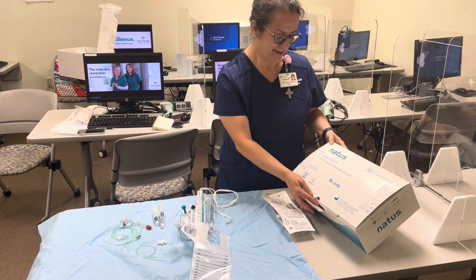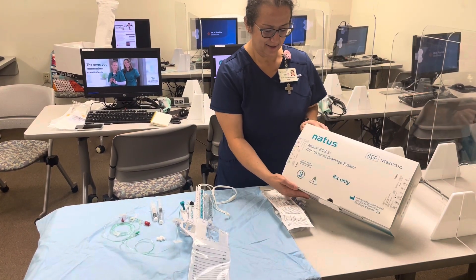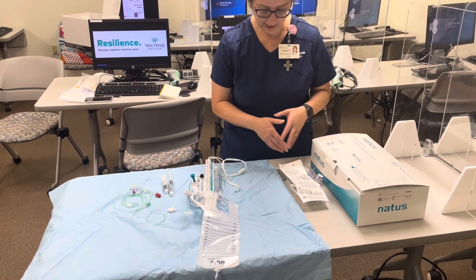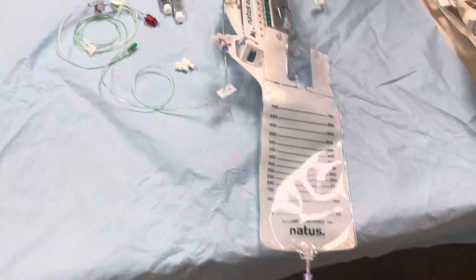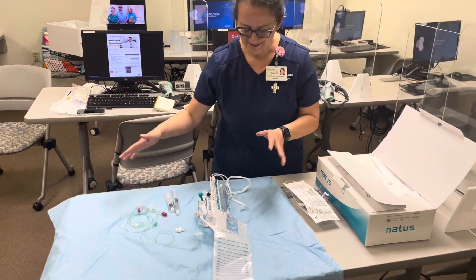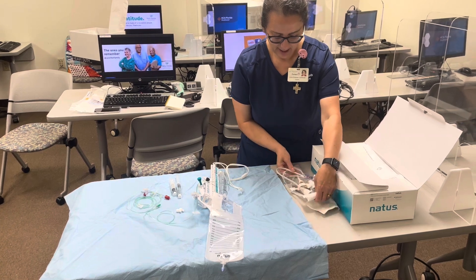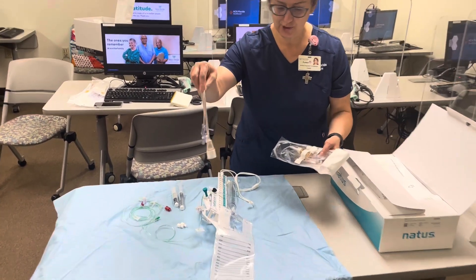We're going to set up an EVD external drainage system. You need the EVD drainage system setup and an arterial line kit. I already have the EVD drainage setup on the table. Please use sterile gloves and have your sterile towel on the table — for the purpose of demonstration I'm not wearing gloves, but in real life please wear gloves. For the art line kit, the only piece you need is a transducer — you can get rid of all the other pieces.